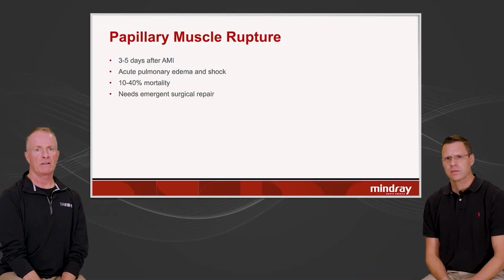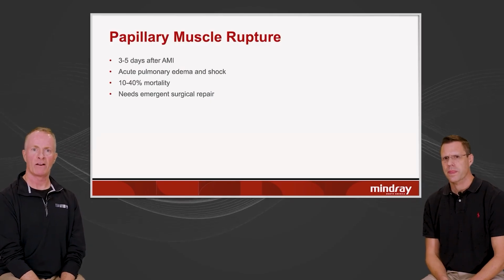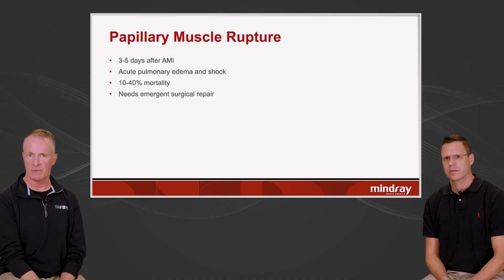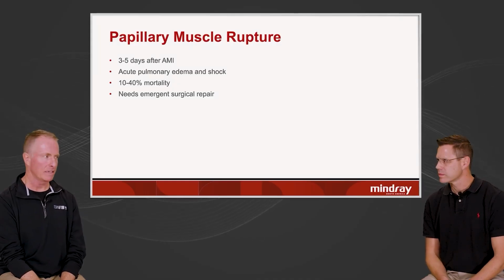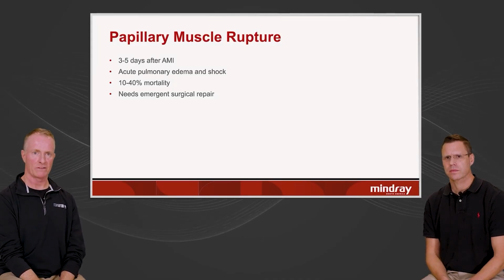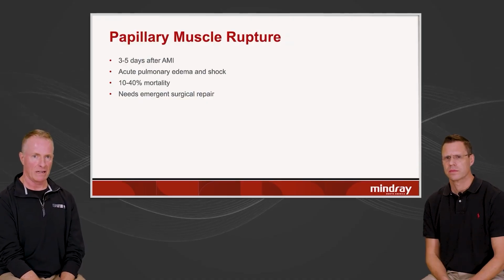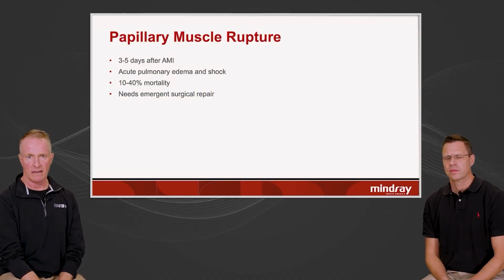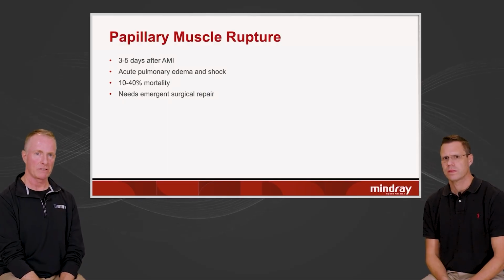Papillary muscle rupture is something, like I said, that's hard to diagnose, especially if it's a full papillary muscle rupture. That person is going to be very sick. They're going to have pulmonary edema and be in shock and be very tachycardic. And it's hard to diagnose anything in the heart when the patient's extremely tachycardic, but you have to have a high index of suspicion for this in a patient with this picture.